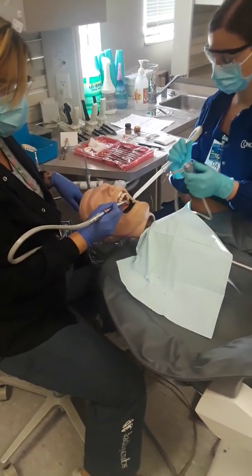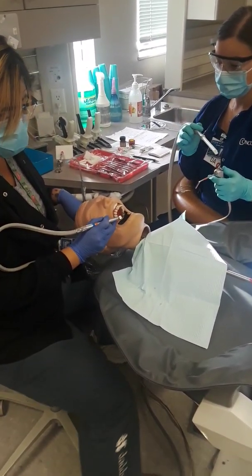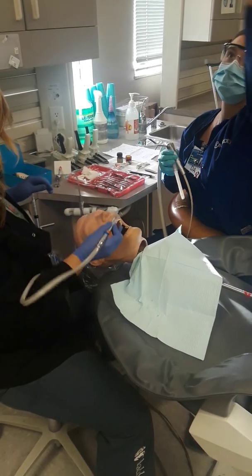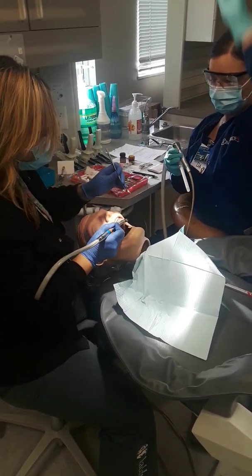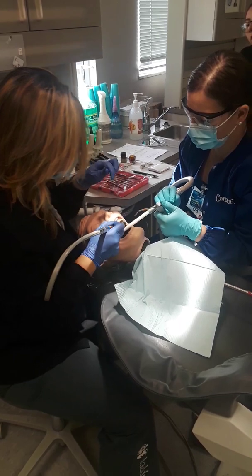I got cords on my stuff. So in this process right now, if I use a 557, there might be decay present, or we need to remove something. Don't forget my light. So we're going to gain access to the tooth, prep. And then let's see, let's move you. Yep, right there, perfect.